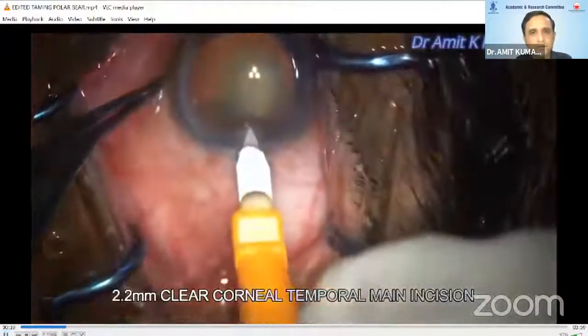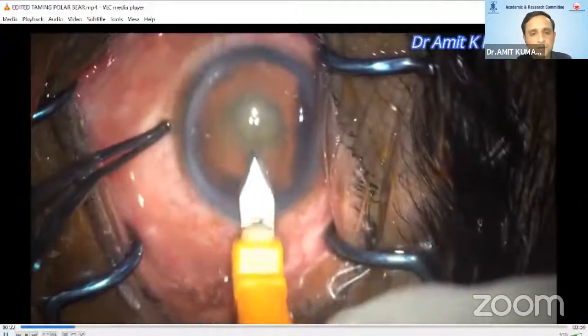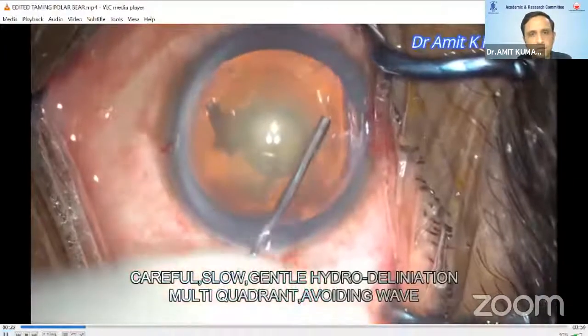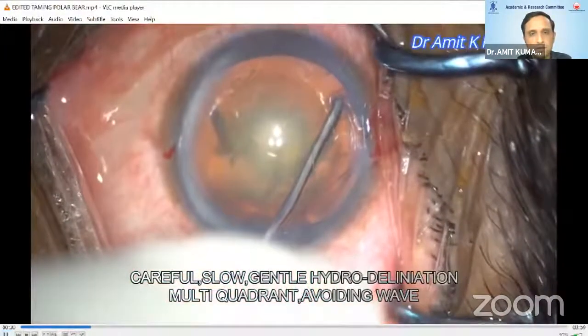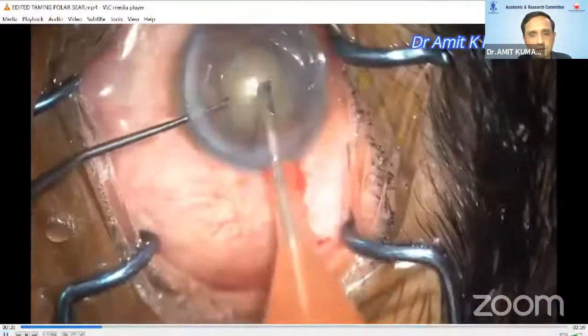It should be at least 5.5 millimeters, as a smaller rexis may invite many surgical difficulties. A 2.2 main wound is done. Now, small aliquots of fluid are injected in multiple quadrants taking care that the fluid wave should not cross the center.